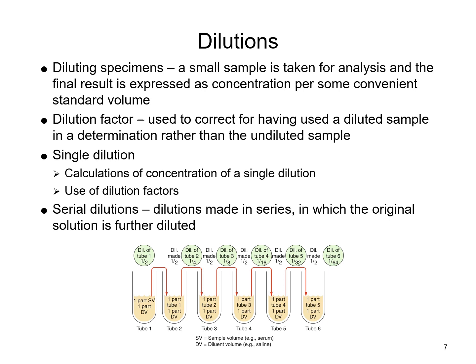You could use this for monitoring whether antibody titers are getting stronger or weaker. Whatever the particular procedure says you need to do, that's what you need to follow if you do a dilution.